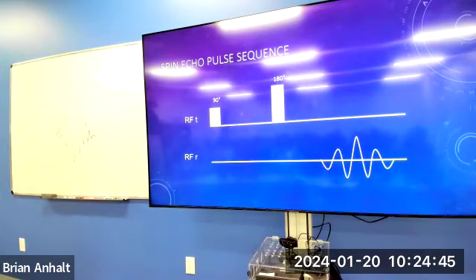Do we do the 180 flip in order to make it longer for the T2? We can look at it like longer. Is that why we do the 180 flip? Well, if we want to get true T2 information, we have to eliminate T2 star information. But yes, we also want a longer TE if we're looking for the differences in dephasing times, right?